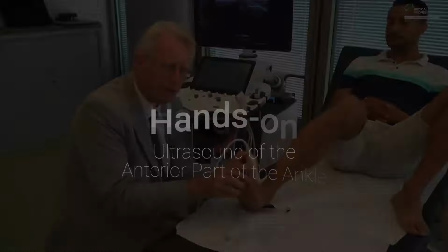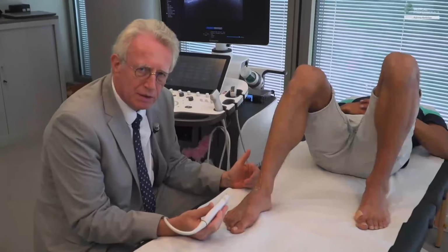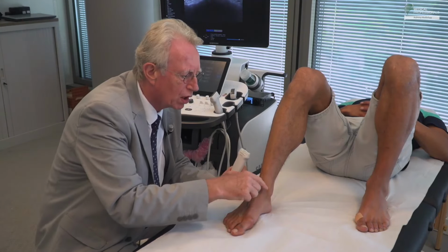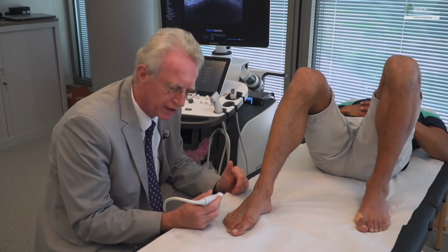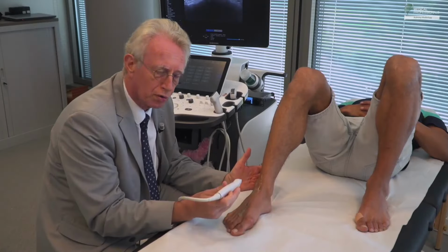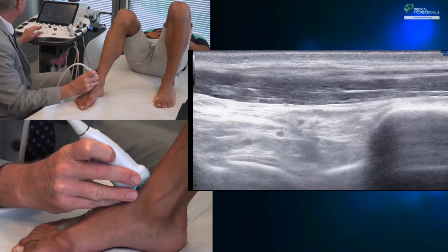We are now going to analyze the anterior surface of this ankle and tarsus. When a patient has a talocrural pathology, they always say the same thing. I have an arciform pain in the anterior part of my talocrural joint. Not really. They will actually just say, I have pain in my ankle. In any case, we are looking for a synovitis, an effusion, or an osteochondromatous nodule embedded in the anterior recess.